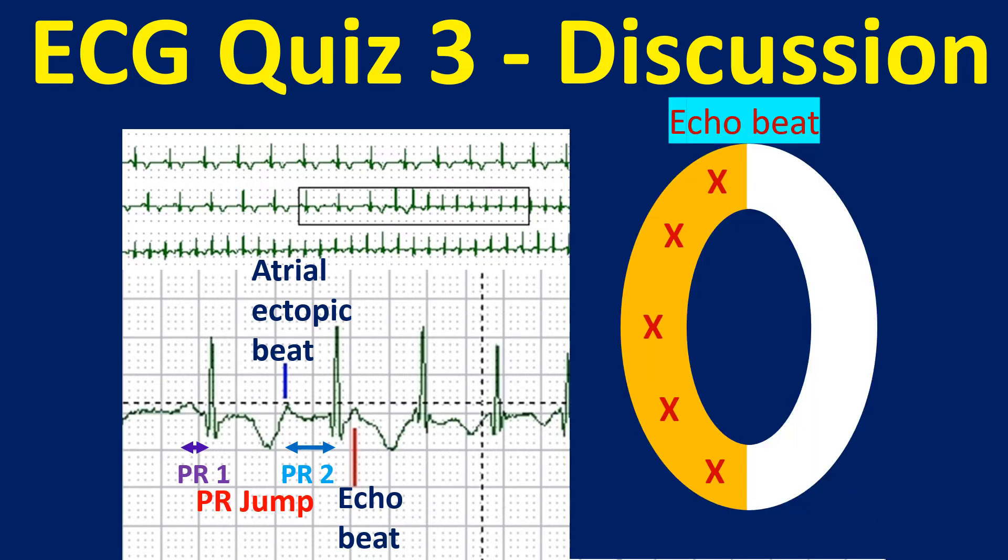PR jump has to be more than 50 ms to be significant. The atrial ectopic beat then gets conducted back into the atrium through the fast pathway, which has recovered by this time, producing an echo beat.